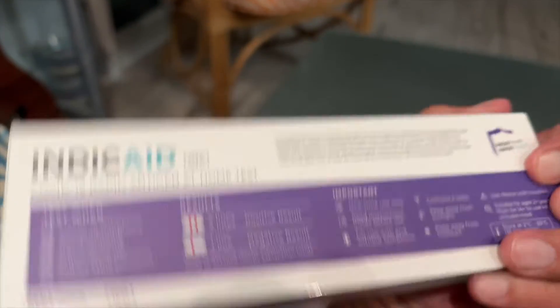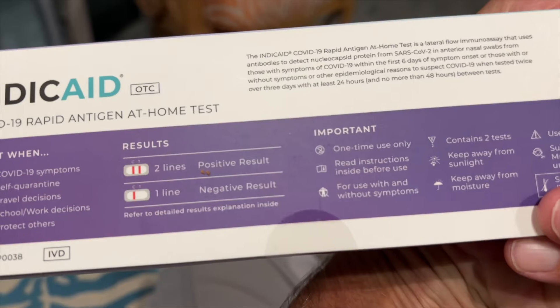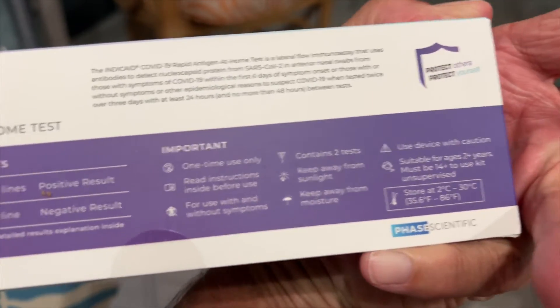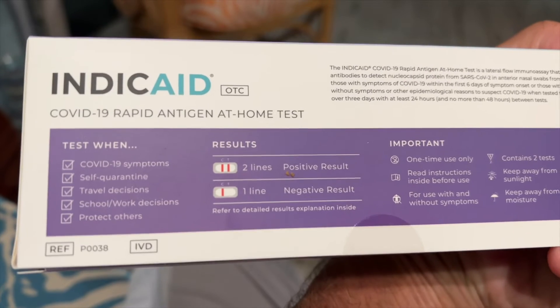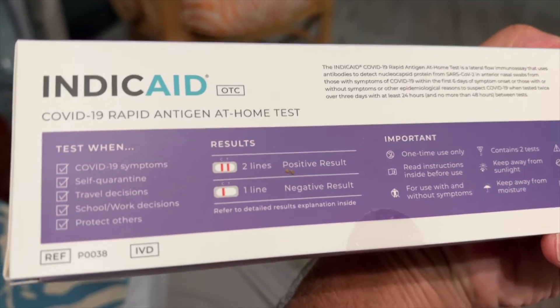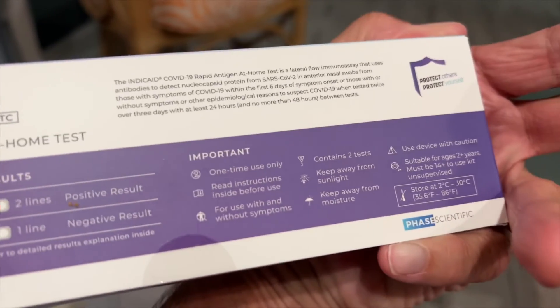Here's how you do it — right here it says two lines positive, one line negative. And here are some important things: test when you have COVID-19 symptoms, self-quarantine, travel decisions, school, work — all of that. All right, let's give it a shot.